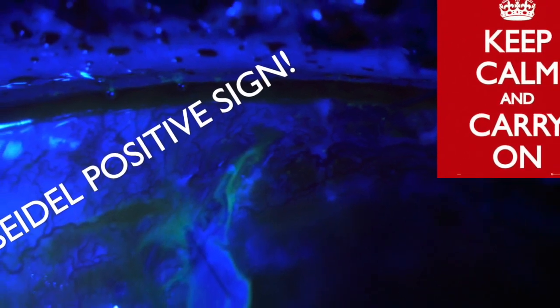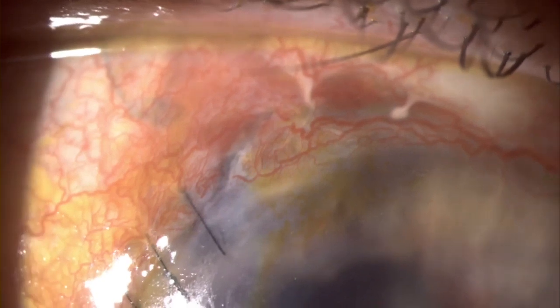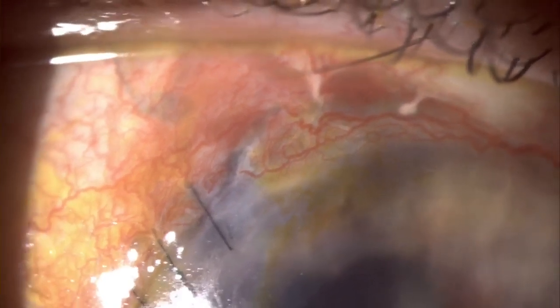Today I'm going to be teaching you about the Seidel sign. We had a patient with blunt ocular trauma and globe rupture. This was repaired, but when I reviewed the patient, they had a Seidel positive sign.